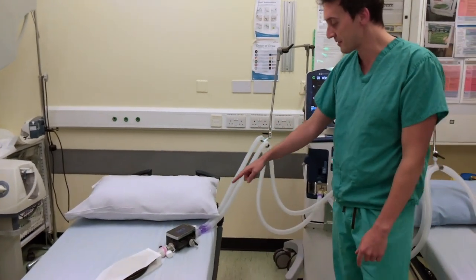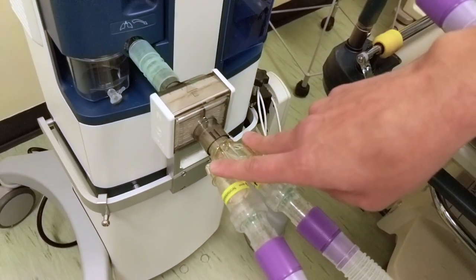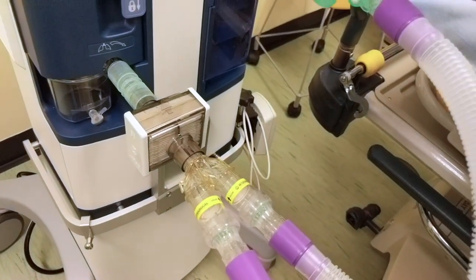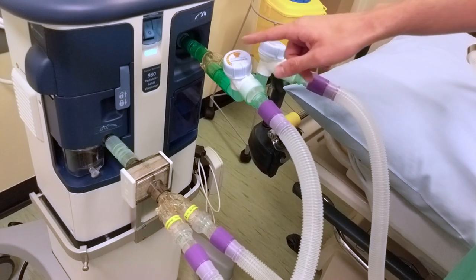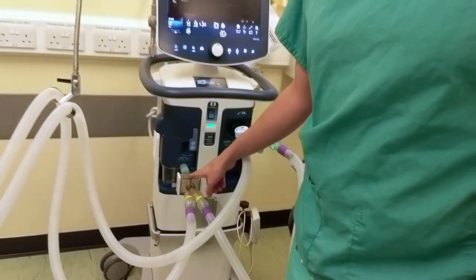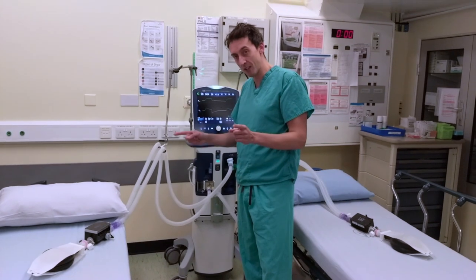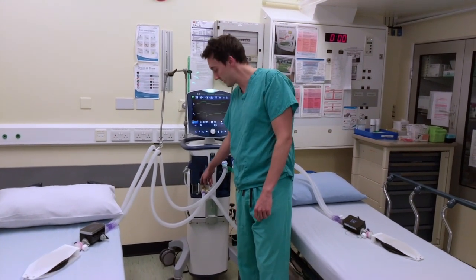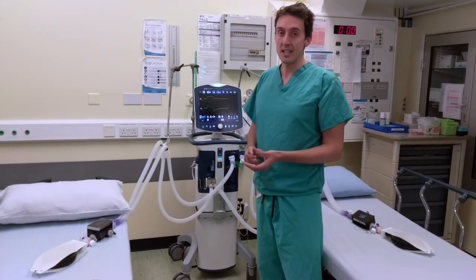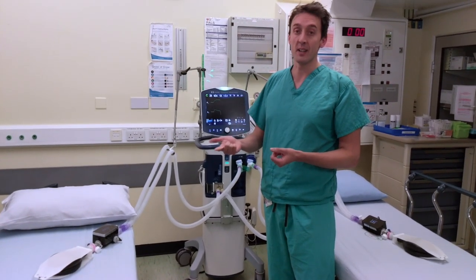Then as the gas returns towards the ventilator, the expiratory limb returns, and before the Y connector encounters a one-way valve. That one-way valve ensures that adjustments to either limb don't affect the other limb unduly. And then we have a second viral filter to be absolutely sure that there's no cross-contamination between the circuits or back to the machine itself. So that's what you're seeing. This is a result of a great deal of collaboration between clinicians and the local med tech sector in Galway. That's researchers and people in the industry.